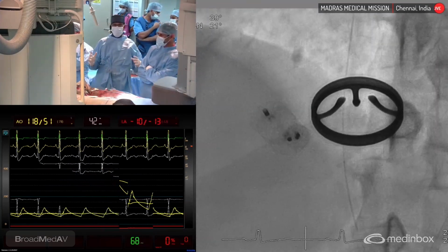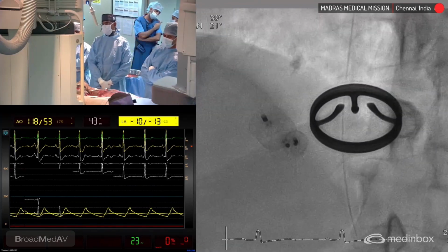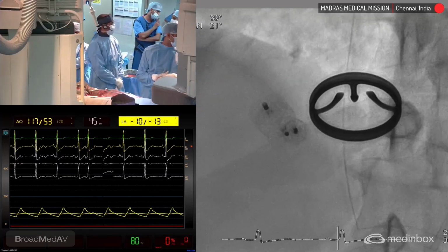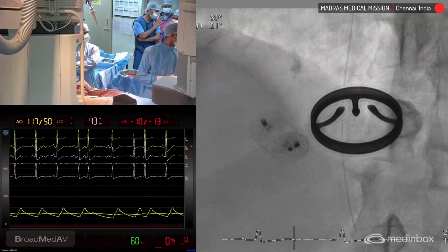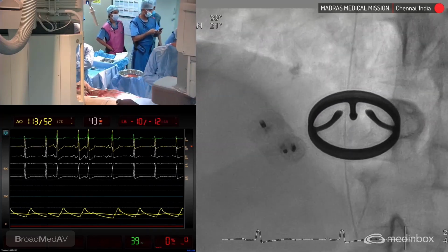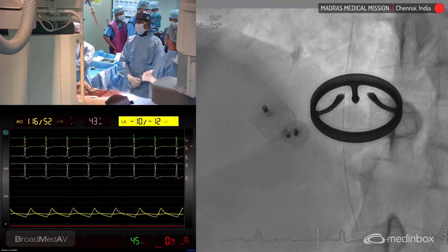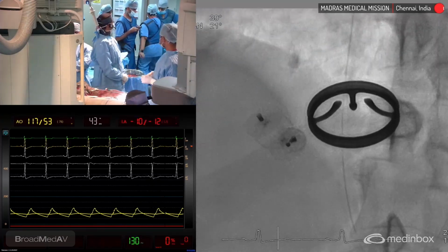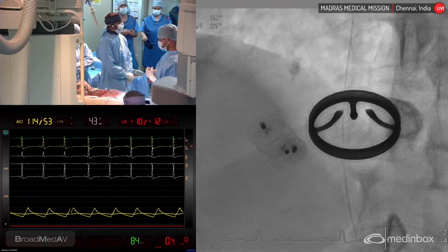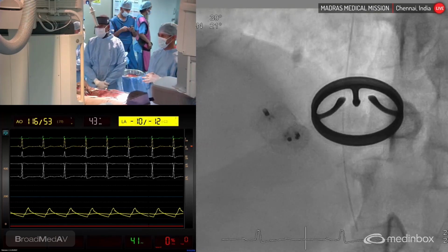So let us do the last checkup, Srija. You have to now give the final verdict. There is still a lot of spontaneous contrast. We have topped up the heparin. How much did you give? 6,000 initially, followed by 2,000. I want another 6,000. So that means give another 4,000 more. The ACT was 120, no, Tejasvi? ACT was 120. So that means a full top up of the heparin. Give 6,000 once again.